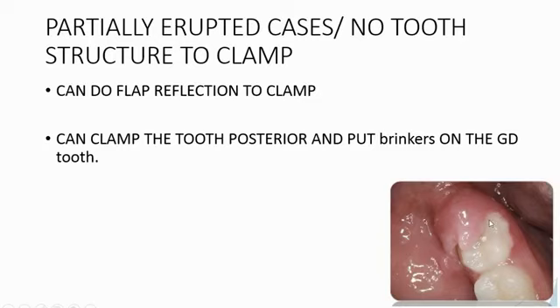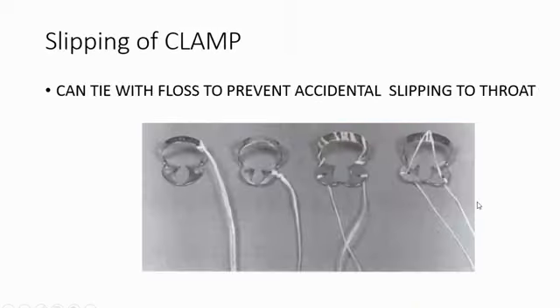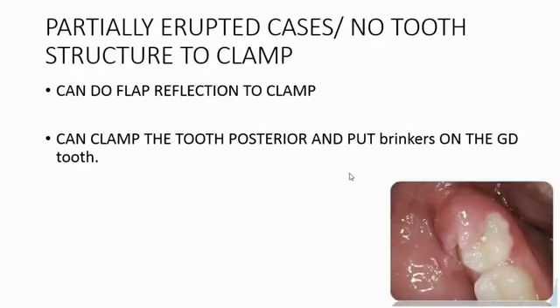I'll be telling you the details of the components of the rubber dam, so that the prongs attach well below the cervical section, in the cervical area of the tooth. You can just raise a little flap.